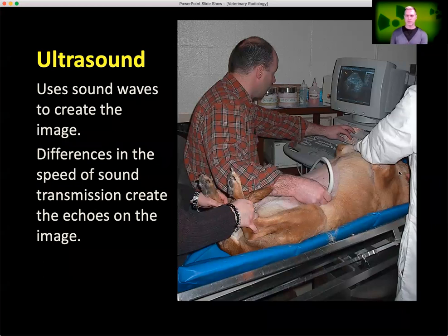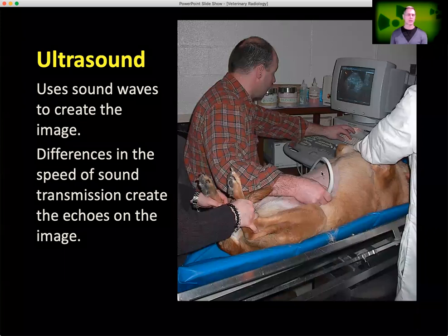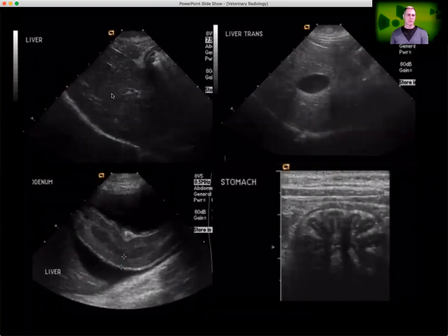Ultrasounding a dog's abdomen, we usually just put them on their back in a nice soft padded trough and shave their abdomen so that we can get good contact. Ultrasound doesn't really penetrate hair very well because the air trapped within it tends to scatter all of the ultrasound back. So we need to shave them and put a little gel on the abdomen to get good contact, and then we can make an image. Images like this, where we have an image of the liver here, which is this structure right here.